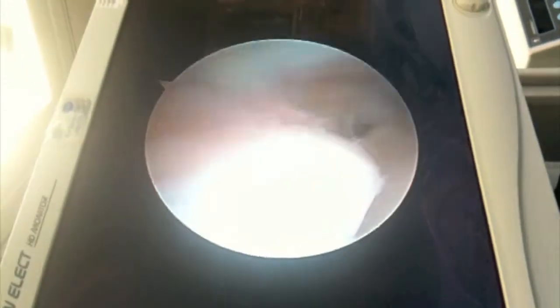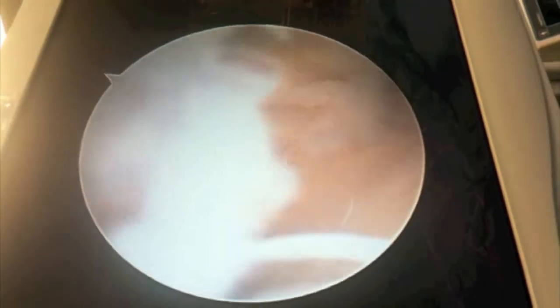Over here is the screen, and now you can look inside to see what I'm doing. This is the scope as I'm moving it around, and here's the instrument that I placed in on the other side of the foot. As you can see, there are a few things we need to clean up in this joint, dangling around in there.